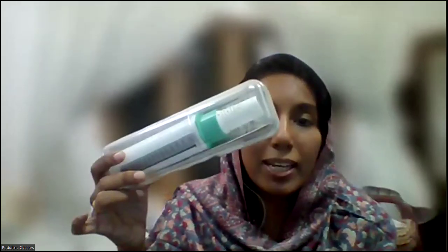So this is the peak expiratory flow meter, which we use for measuring the peak expiratory flow. I'm taking it out of this case. This is the peak expiratory flow meter. This is C+. I'm not endorsing any brand, but this is the one which I generally use. This is written Breathometer. It has different markings, which we'll discuss soon in this video. With this introduction, let me start sharing my screen.